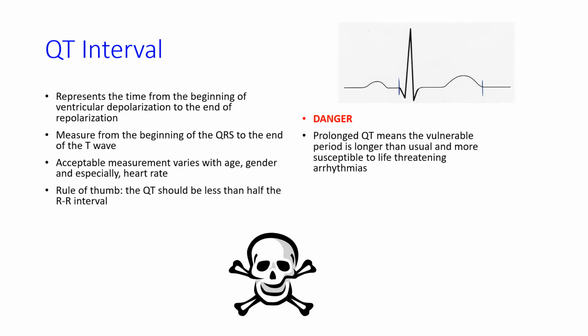QT interval. So again, this is where you're going to be measuring your QT intervals routinely. Even though Huff, the book, does not give the answer for your QT intervals, we do, as a consortium, want our people to know how to measure QT intervals, because there's lots of things that can cause a prolonging of your QT, such as hypokalemia, hypocalcemia, hypomagnesemia.